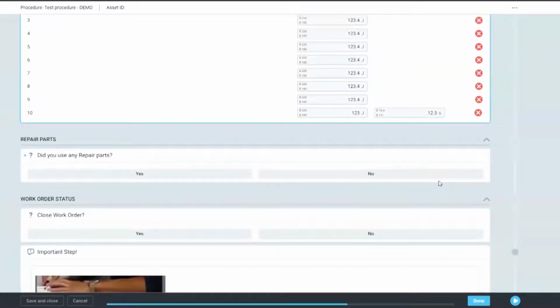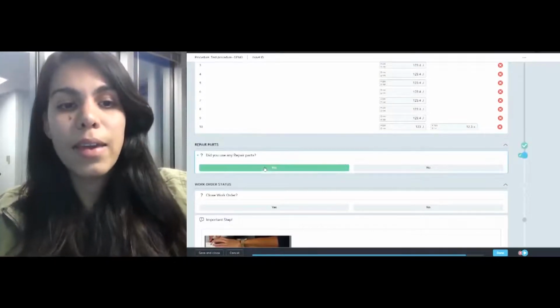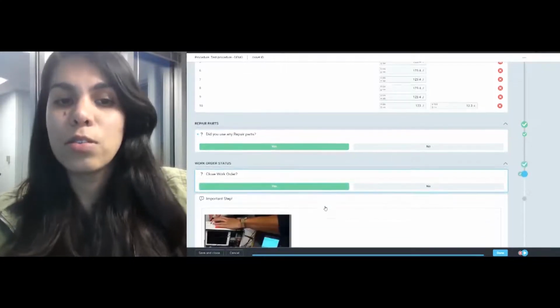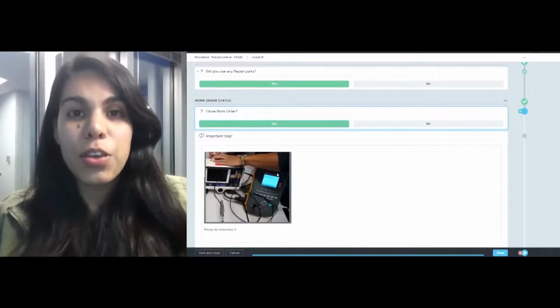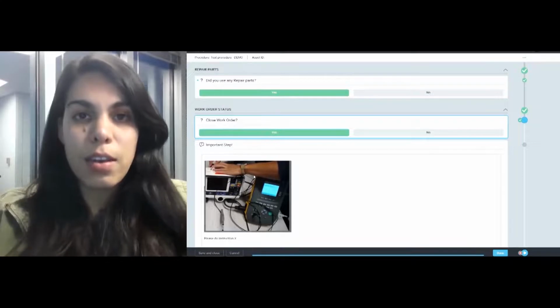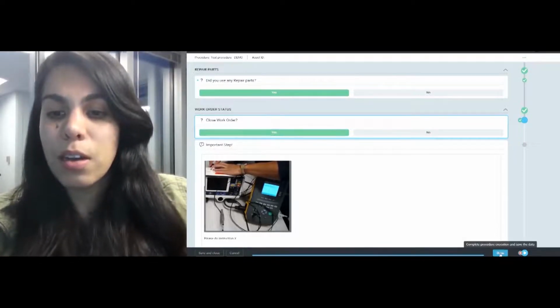So let's say, for example, I'd like my tech to answer a couple of questions in the beginning or at the end. I can add a few questions. So let's say I'd like to close this work order. And important step, I also would like you to visually see that step to ensure that the understanding is there. So I've also added that. So at the end, I just gotta press done, and now the report will be generated.